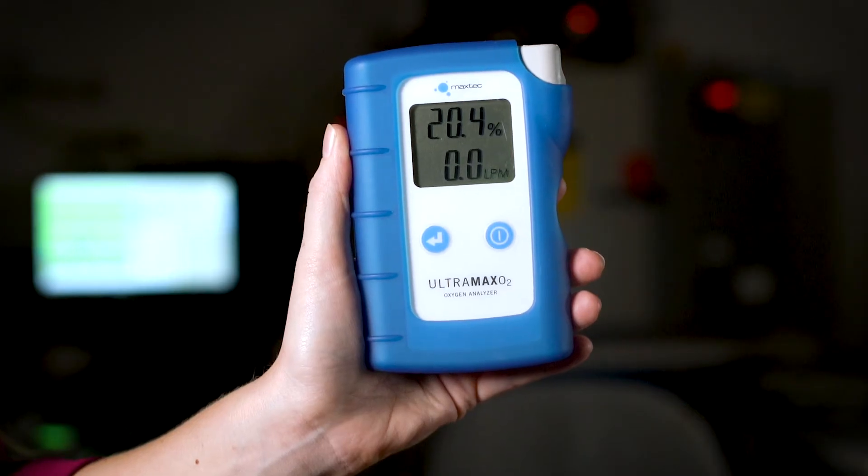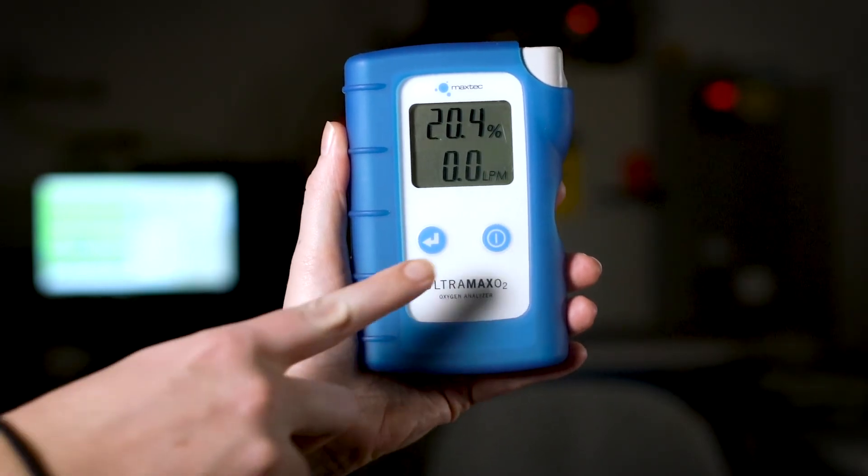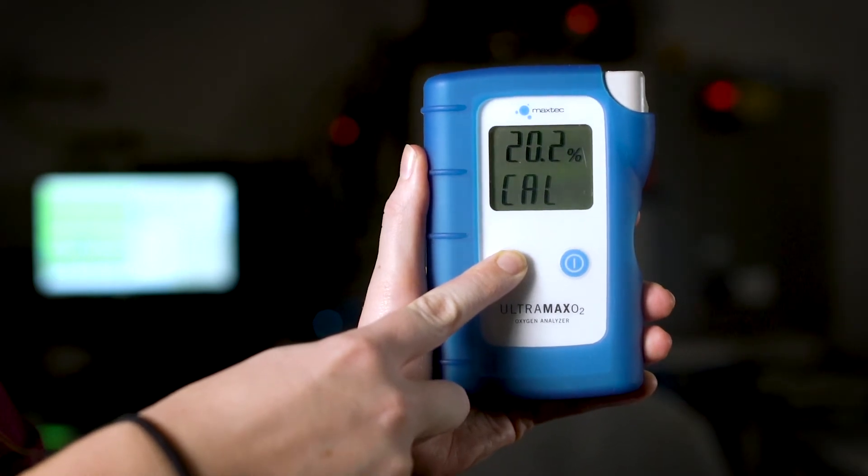Saving you time. To verify that the oxygen level is calibrated within 99 and 101%, simply press and hold the mode button to display the calibration verification screen.